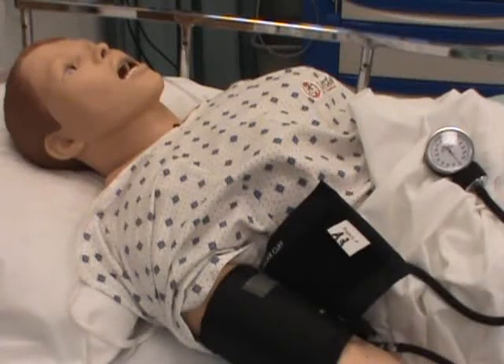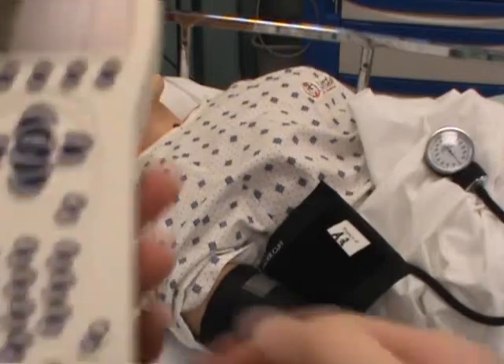Let's talk about setting bowel sounds on the VitalSims mannequin. I've turned on my main power supply, I turn on my remote, and I have a default setting.